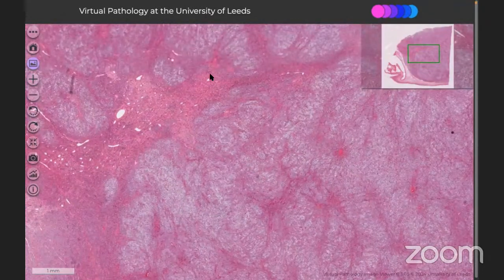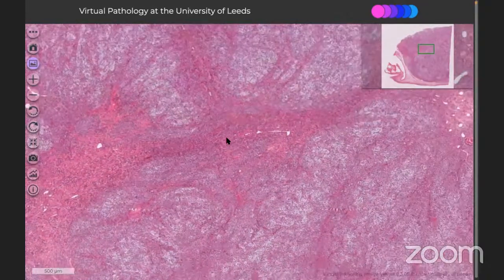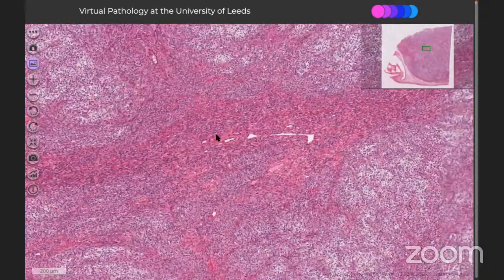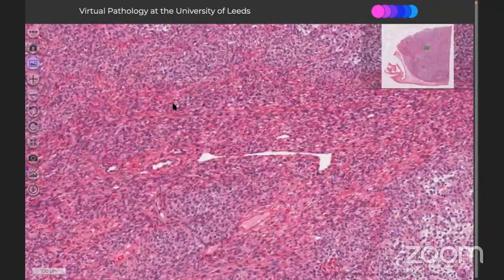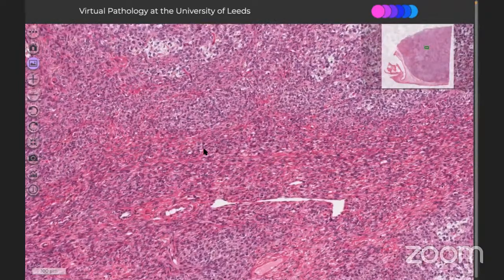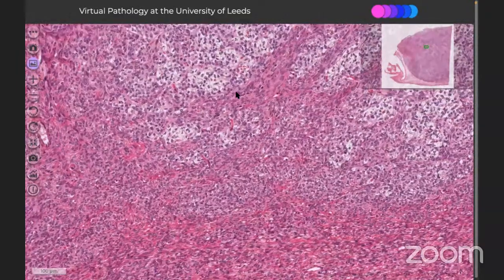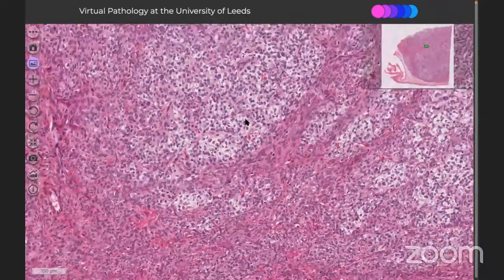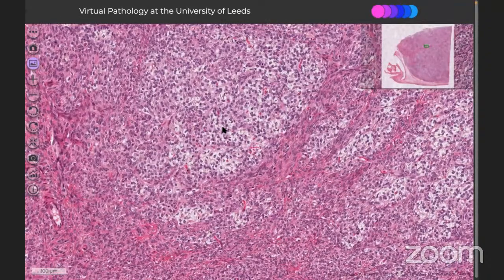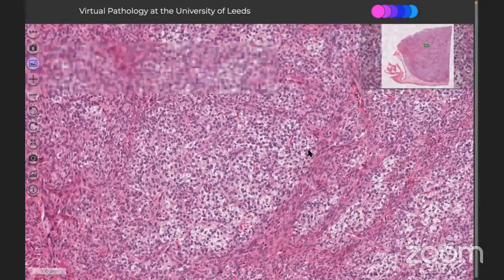So individual nodules or lobules are separated by fibrous septa, and the septa also have a cellular component which is plump to spindle, and they are gradually acquiring more amount of cytoplasm, and there is a component of clusters or nodules of clear cells, which is suggestive of luteinization.